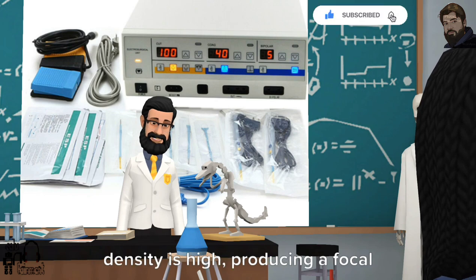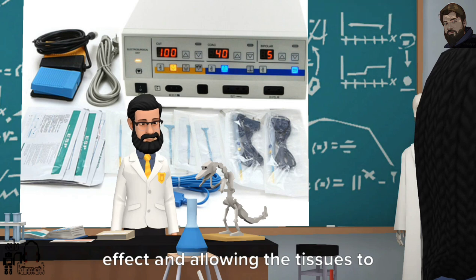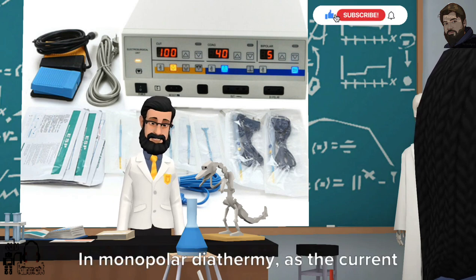Due to the small surface area at the point of the electrode, the current density is high, producing a focal effect and allowing the tissues to heat up rapidly.